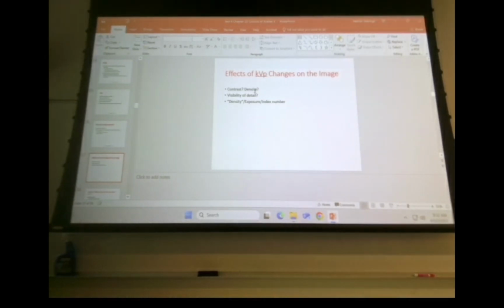And we just don't see that in digital processing anymore because the main thing that controls your contrast is the computer algorithm. Exactly. So visibility of detail, anytime you see visibility functions, what we're talking about there is contrast. Okay, so you have sharpness of recorded detail, and that's how fuzzy the image might appear, and then you've got visibility, which is your contrast.